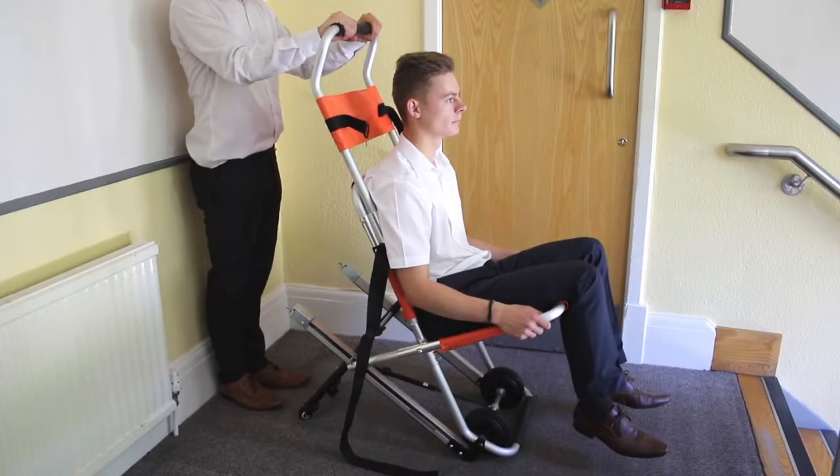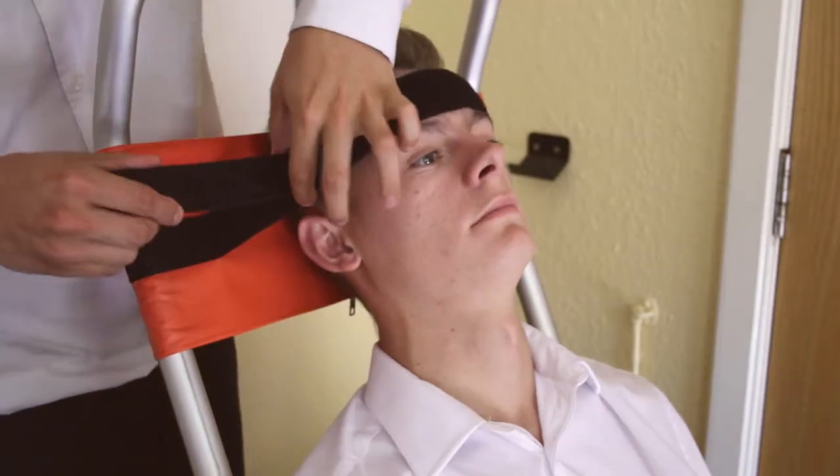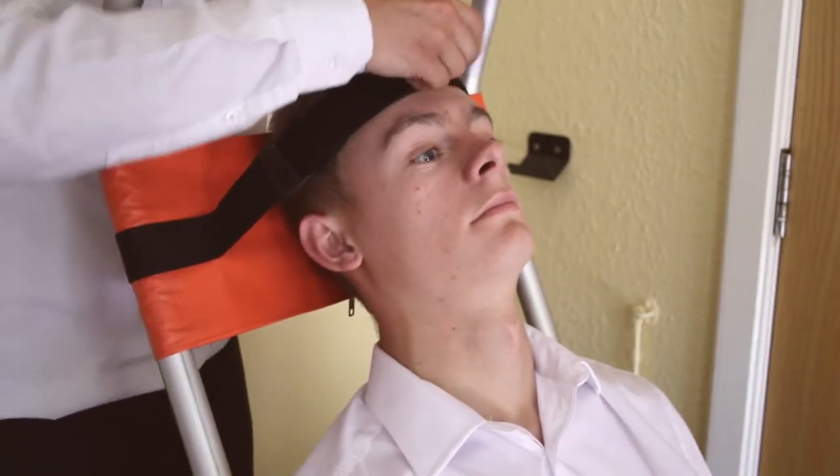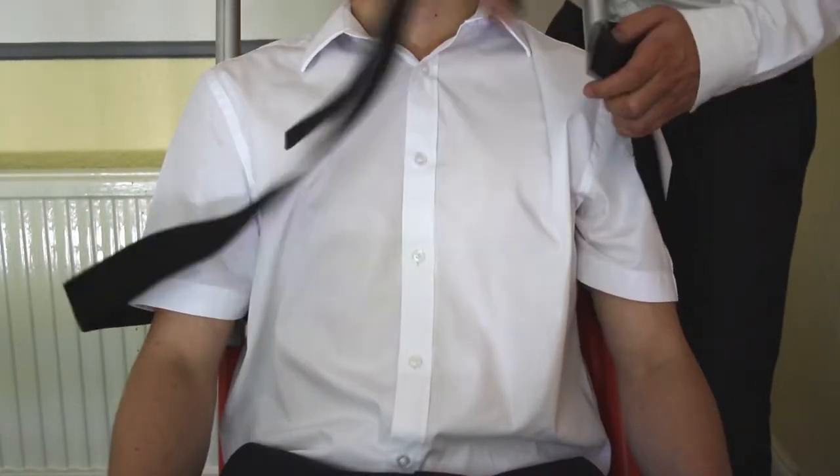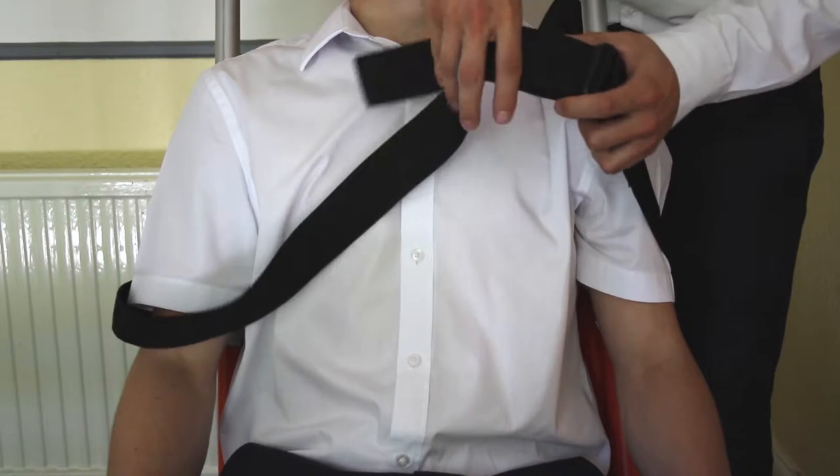To securely fasten the passenger into the evacuation chair, tighten the head strap. Slide the belt buckle to its full length, wrap around the front of the passenger, click into the buckle and tighten by pulling on the strap.